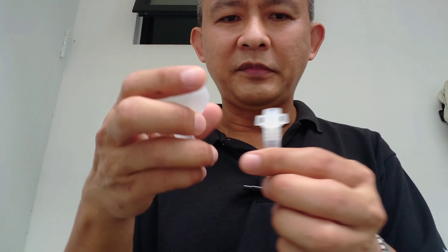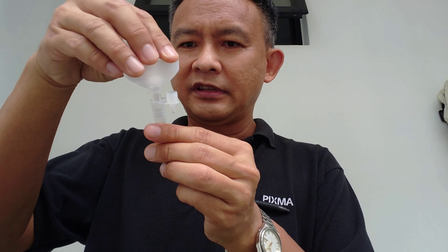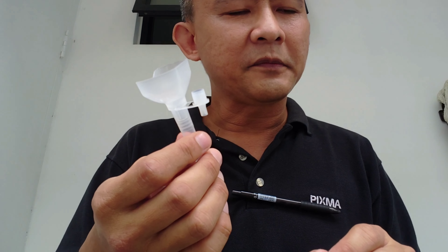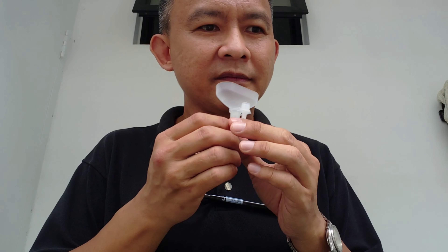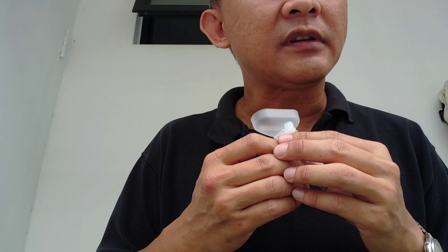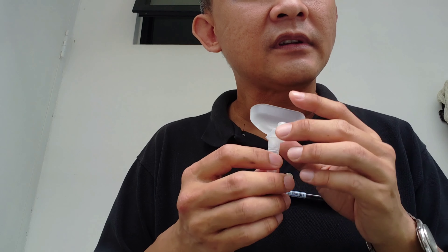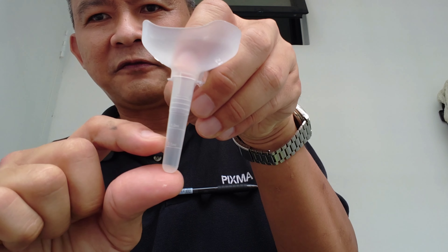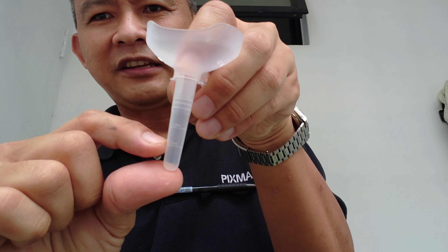Firstly, you take this funnel and this container. You place the funnel into the container like so. Then I have to collect saliva until the first marking over here.